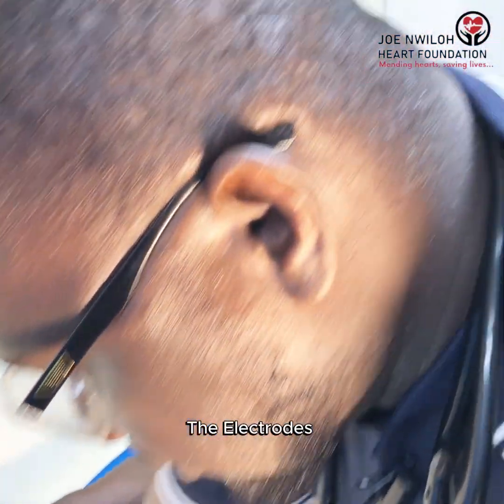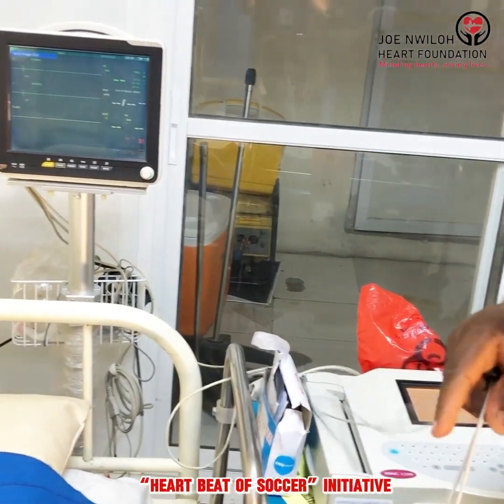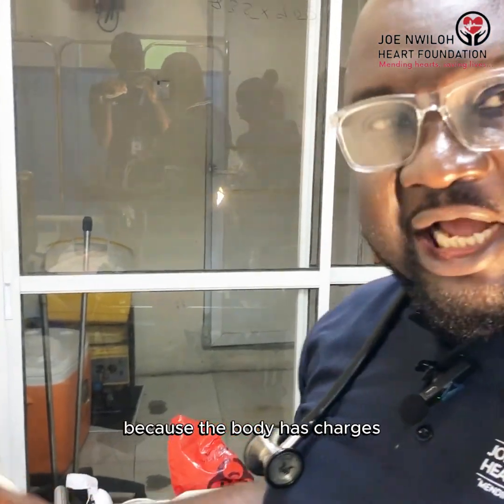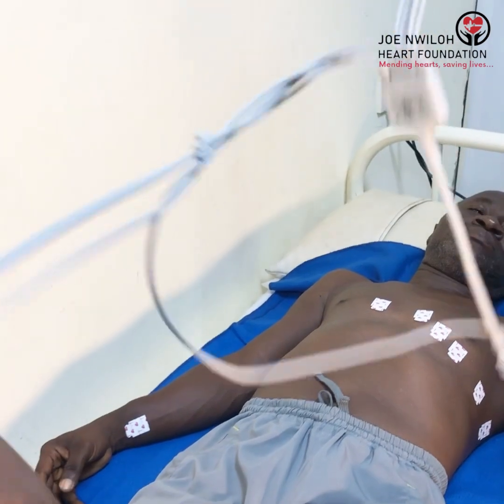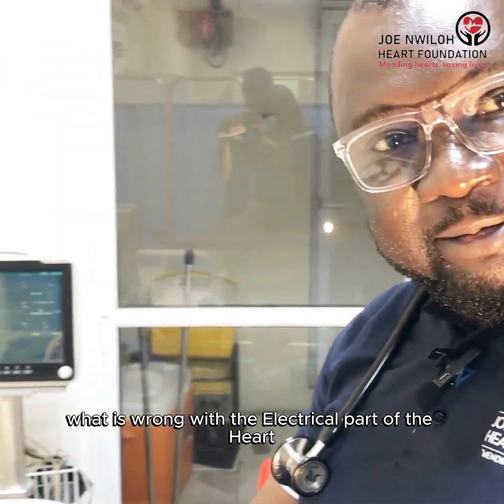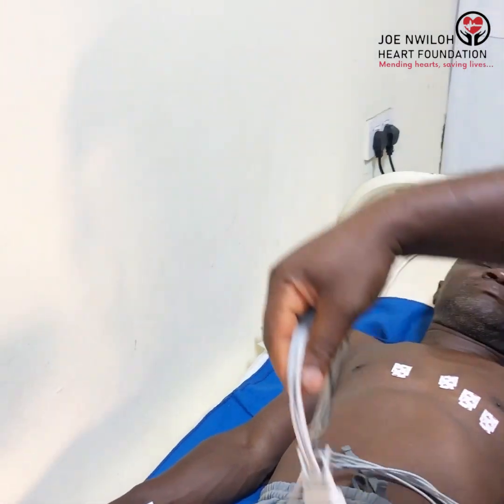The electrodes have to enable electrical conduction to go through. So you can use the leads. So electrical charges will have to go through the lead to the EKG machine. You understand? Because the body has charges, what we call impulses. So that is the work of the electrode, to allow electrical charges to move to the machine, so that the machine can interpret and diagnose what is wrong with the electrical part of the heart. So you can help me to put that.